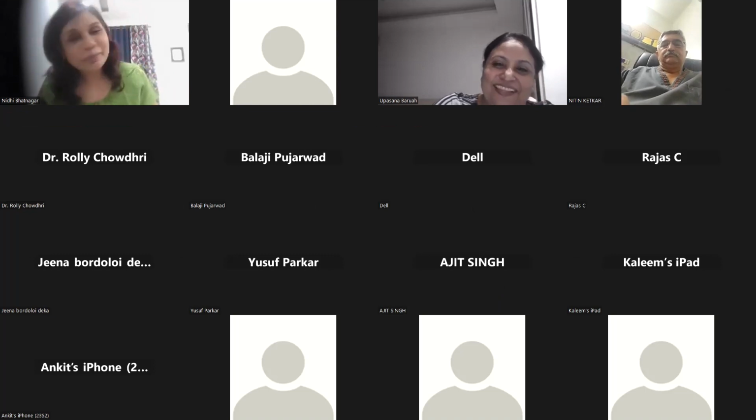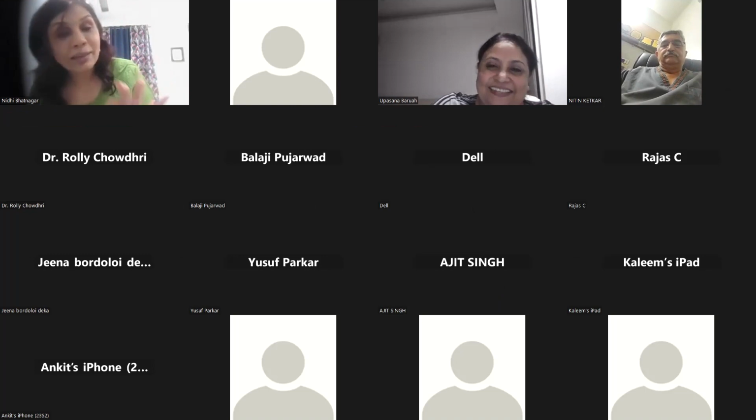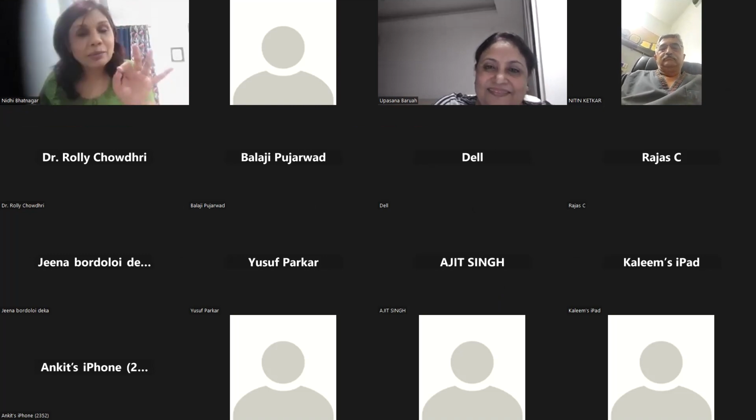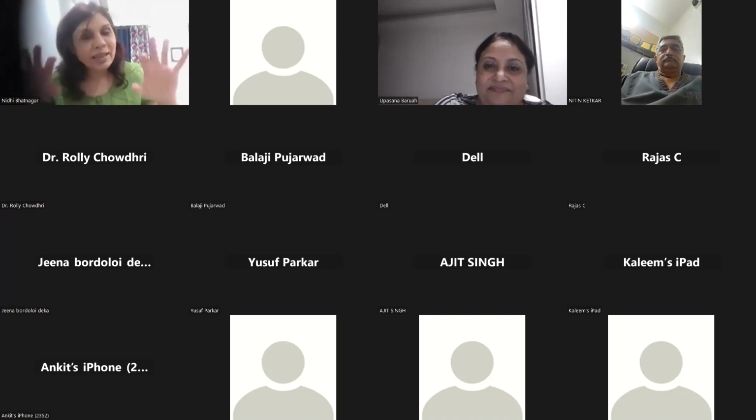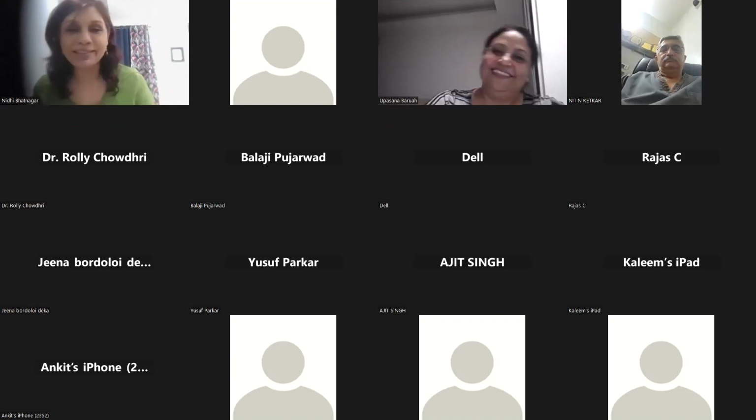But Upasana, absolutely perfect. Very beautiful. You know what is one thing that I'm going to carry home today from your presentation? That these ligaments should be looked at in a real magnified view. Whichever probe you're using, if you keep looking at it in this frame and don't magnify it, you will lose it. Perfect and very, very beautiful. Loved it. Thank you.